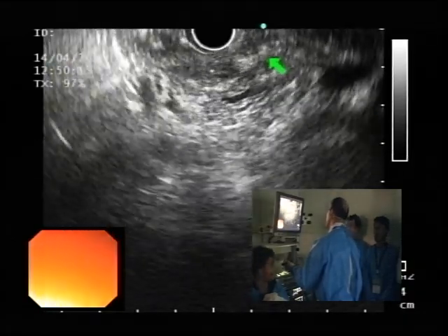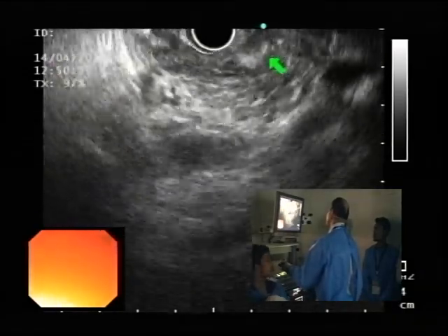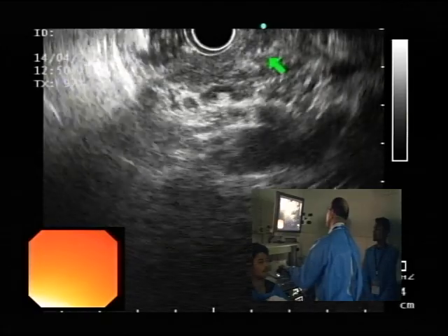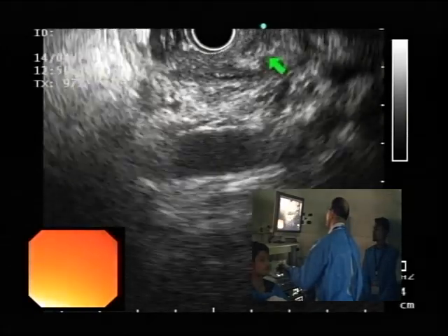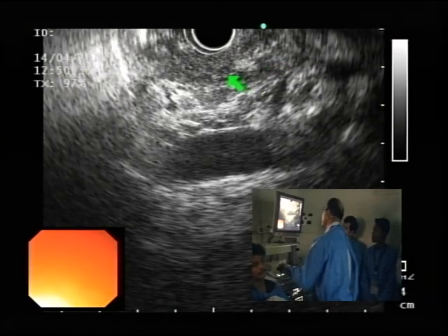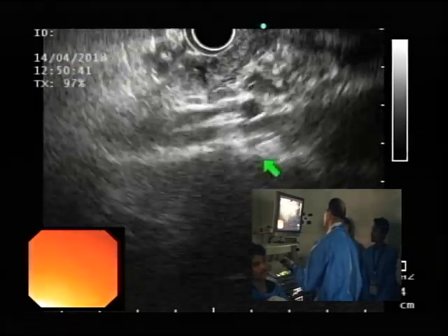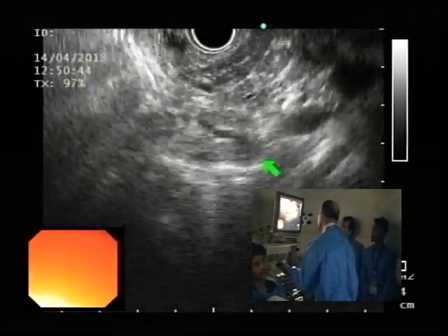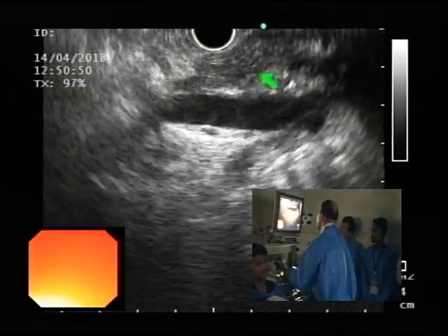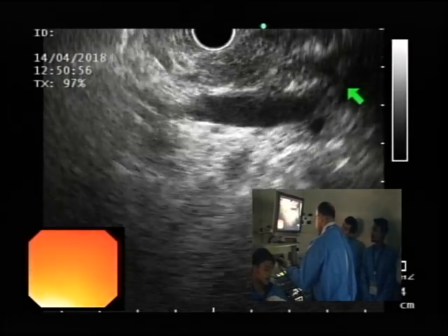We'll have to look for it in a second. But so this is bile duct, because the anatomy on this kid is not clear to me. Clearly the ventral pancreatic duct is not dilated, as Khaled pointed out earlier. And now we found the bile duct, which is small and has air in it. Again, just for reference, it's this structure here. Now, theoretically, in divisum, if you have the bile duct in view, in most cases if you go clockwise, you should be able to see the dorsal duct come in from here and go towards the minor this way. But I've tried that a few times, and I've not been able to see that either.